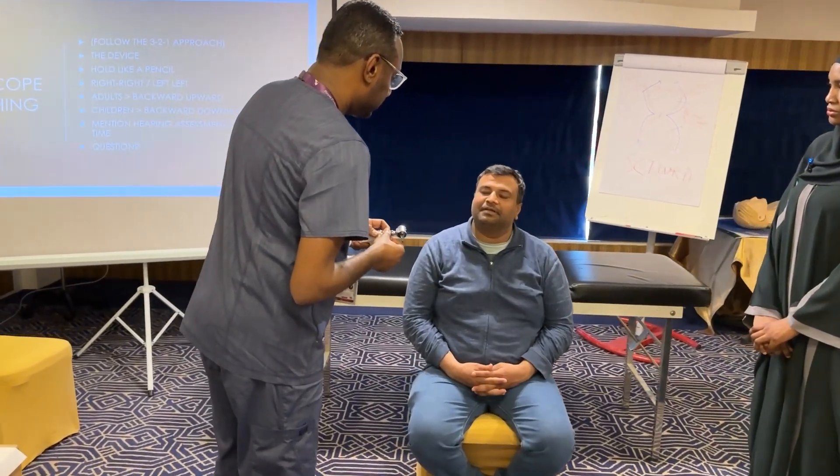So we will go to our patient. Hello, sir. Hello, my name is Mohamed, one of the doctors, nice to meet you. This is my colleague, Dr. Zainab. She's here for the purposes of teaching. Can I know your name please? I'm about 38 years old. Oh, nice to meet you. So I would like to examine your ear today. Is that okay with you? Yes. Zainab will be here for the purposes of teaching. Is that all right? Good. Are you happy that we proceed? Yes.